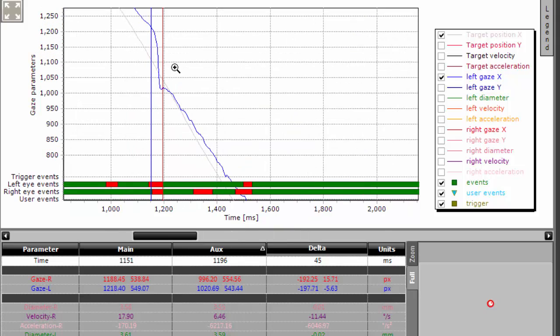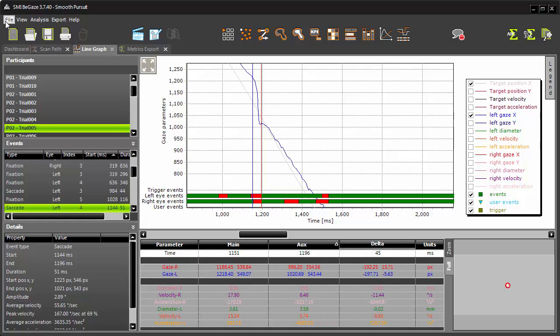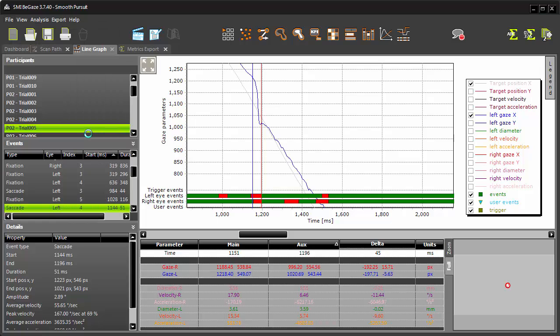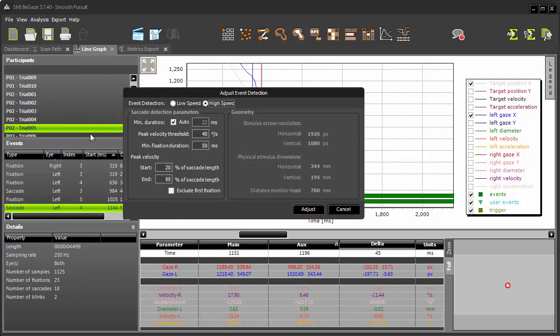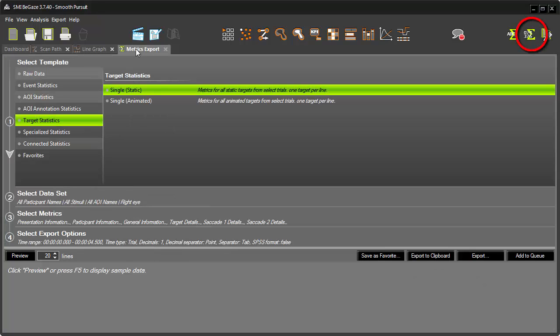You can adjust the event detection parameters by choosing File, Adjust Event Detection.